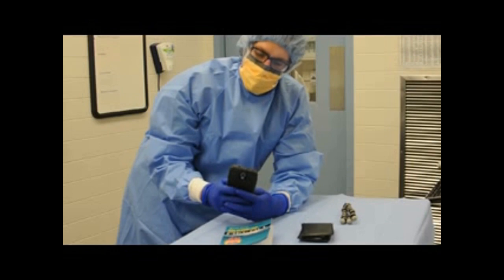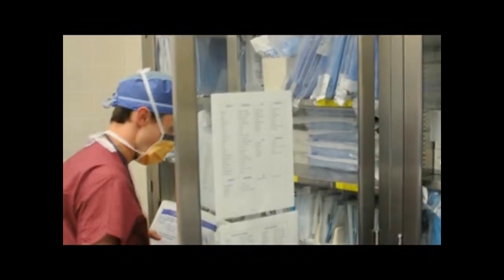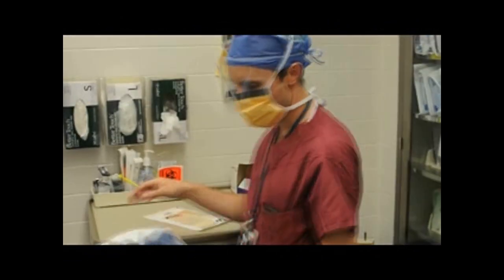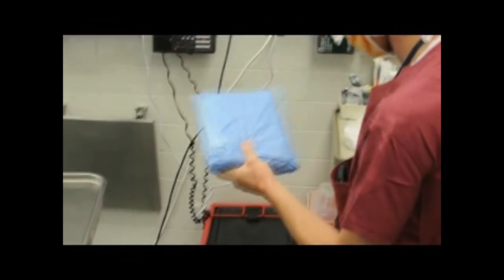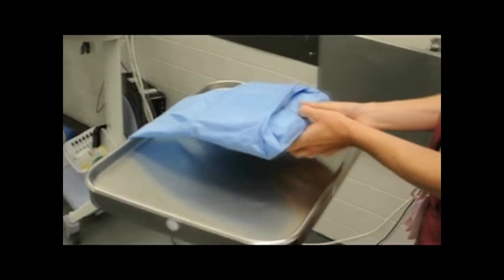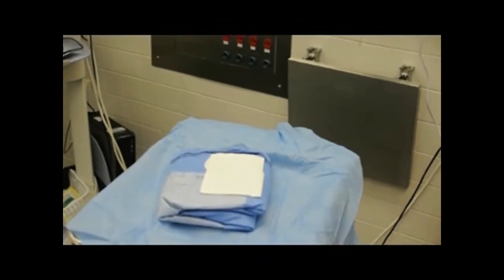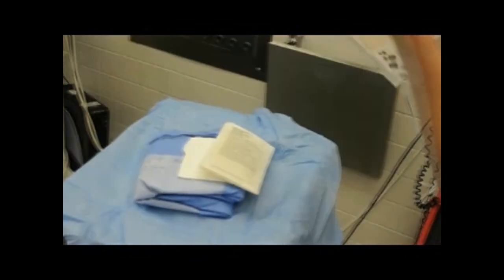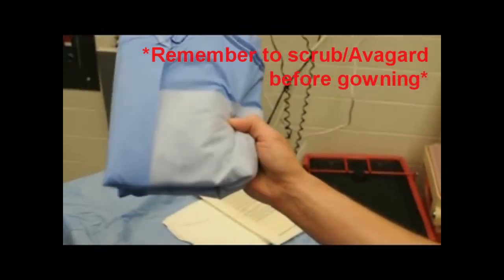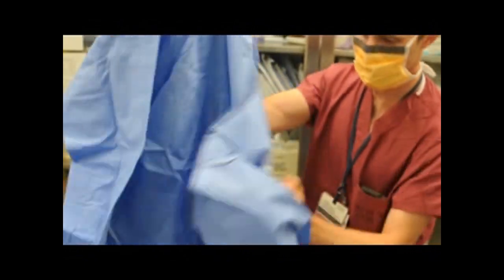Sometimes, like if the scrub tech is busy, you will have to gown and glove yourself, which is a slightly different experience. Grab your gown and gloves just as before and place them on some surface. Open the gown package, remove the gown, and place it on the table. Unfold the flaps so that the sterile gown inside is exposed. Then open your gloves the same way as before, but drop them onto the sterile gown. After you've scrubbed or Avagarded, when sterile, grab the gown so that the opening of the two side flaps — which become your sleeves when unfolded — face you. You can touch this because it will be against your body when you wear it. Slide a hand into each side flap and reach in, letting the gown unfurl, and be careful not to touch anything. A non-sterile person will close up your gown in the back.